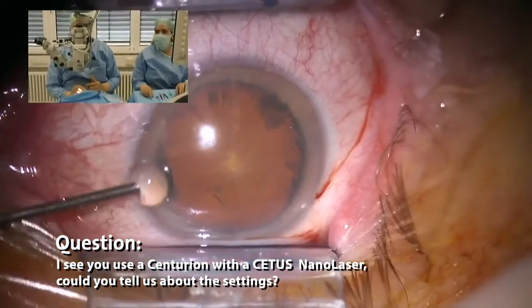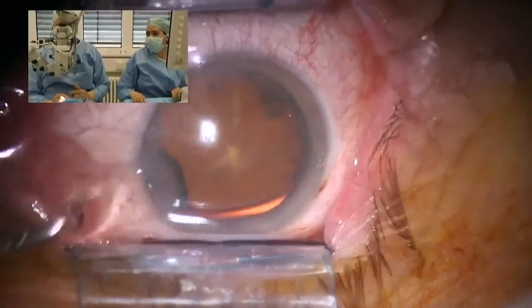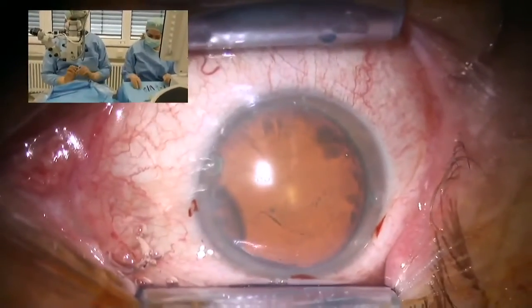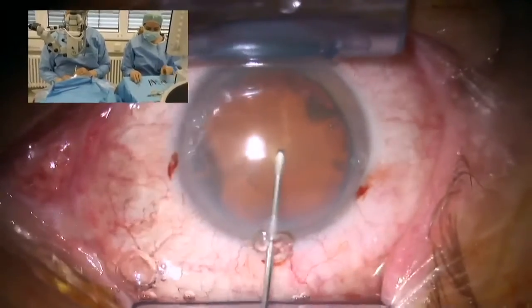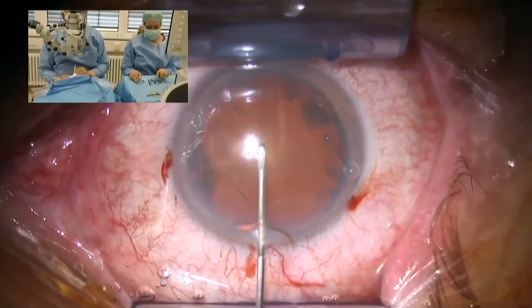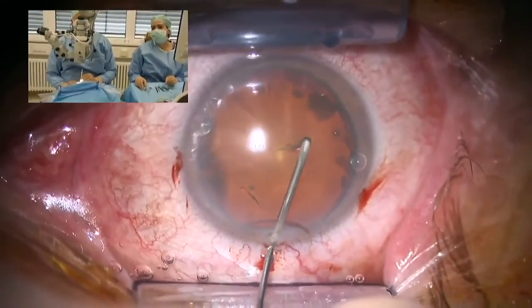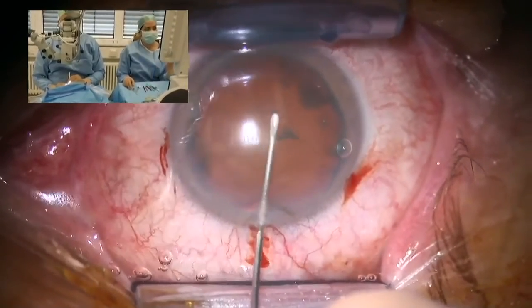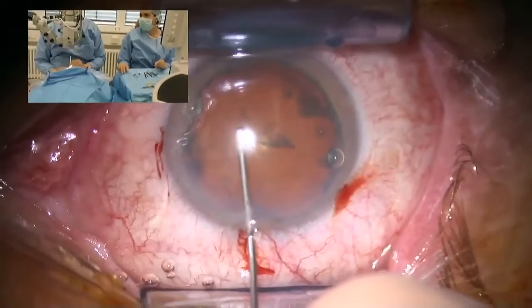I hope the Centurion guys don't get mad at me when I explain it like this. It is very aggressive in the suction force, and we have a flow of, I think, 50. We'll see it later, and an aspiration force of 600 millimeters of mercury.